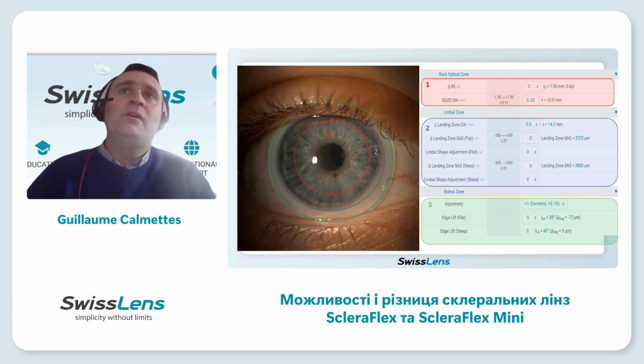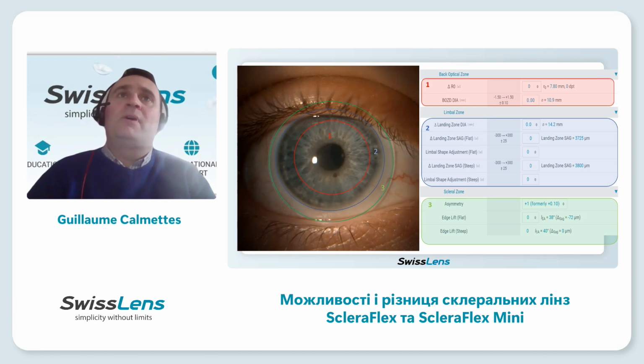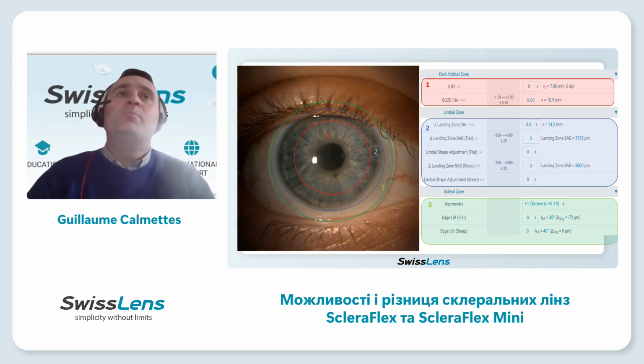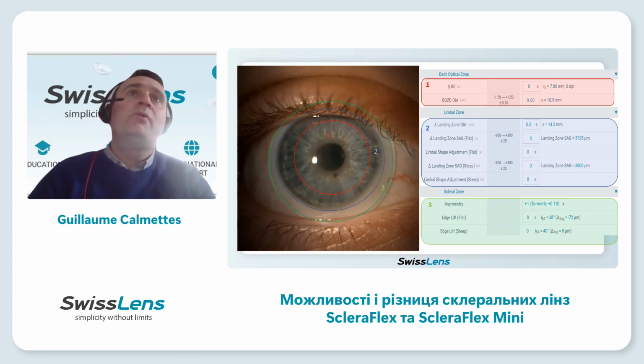And part number 3 is the scleral part, you see. If you change something on the scleral part, don't expect to have any change on the optical zone part. So it's very important to understand that there are different parts in each lens, and when you speak with your technical support, it's important to tell them where you want to have a change so they can help you.